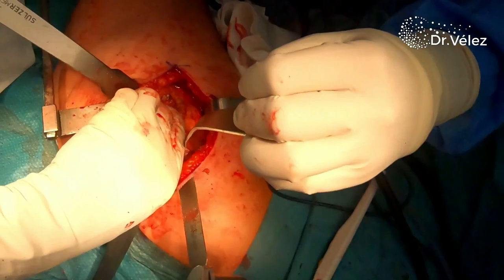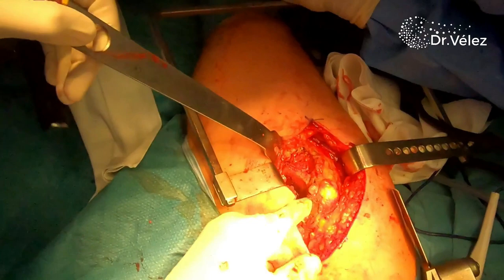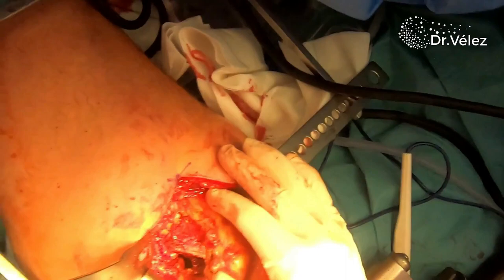After clearing the posterior aspect of the femoral neck, we can use one of the broaches to mark the osteotomy line as pre-planned and as intraoperatively we considered correctly.